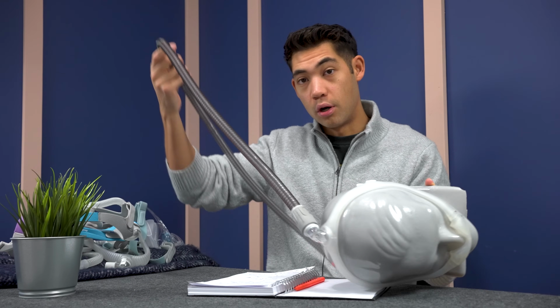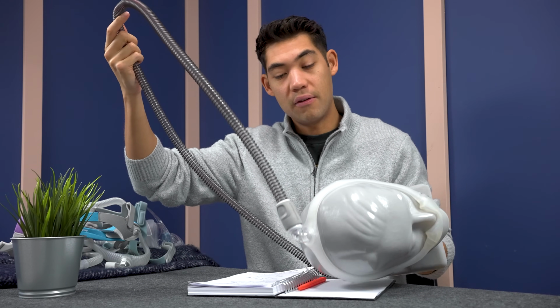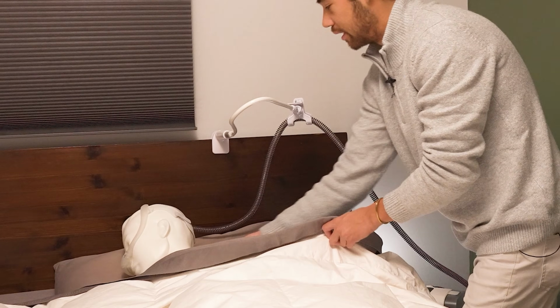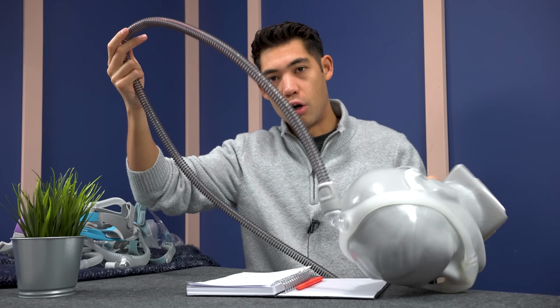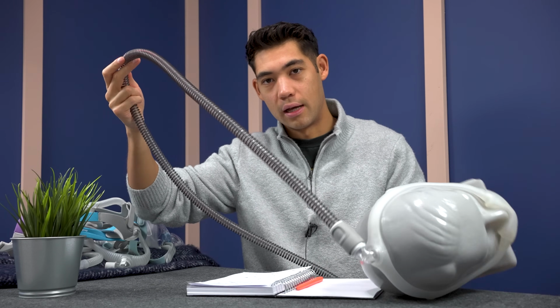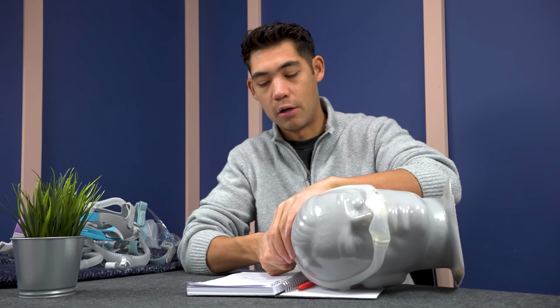Additionally, if you have a tube hook that's on the side of your bed or on the wall, or one that is specifically made for CPAP, it's gonna be keeping that weight of the tube out and away from your face, and you can roll around all day long, okay, on your side, different sides, without the tube being annoying. So that's a big benefit to top mounted masks.